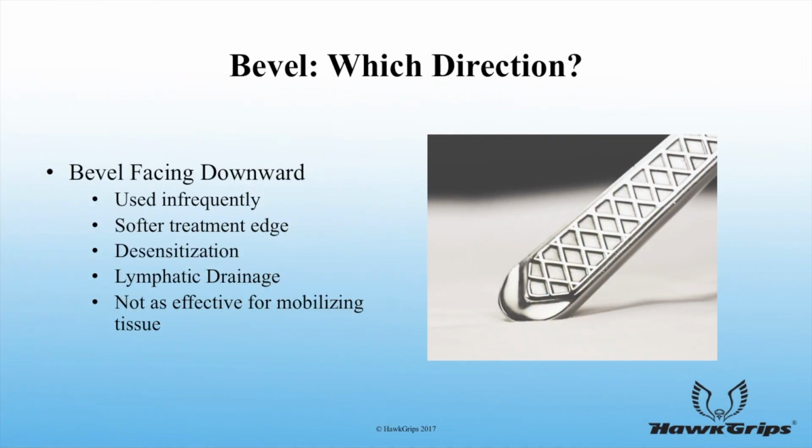The bevel can be utilized with the bevel facing downward. This is used less frequently and is designed to provide a softer treatment. This is ideal for desensitization, mobilizing fluid, or conditions requiring a soft stroke. The bevel sloped downward is not ideal for deeper treatment.